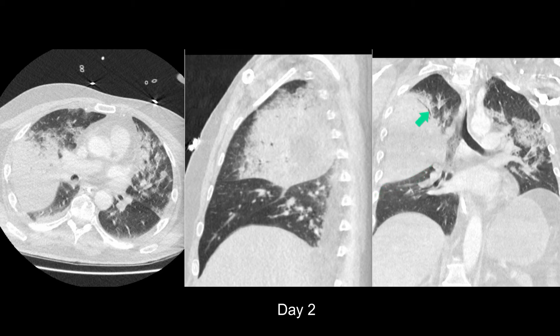Here is the small air bronchogram, and this confirms consolidation in the left mid-zone. The more posterior coronal slices also demonstrate consolidation and atelectasis in the left lower lobe. Also note the mucus in the right main bronchus and trachea. The diagnosis in this patient was Legionella pneumonia.